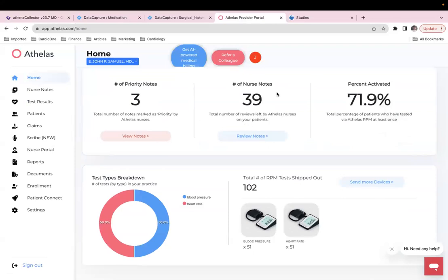But the beauty of this is none of our staff, the providers or the practice staff, need to come here to do anything. I'm just pulling this up to show the complete outsourced services and what they use. We do have visibility, but there is no need for us to come and do anything here because of the integration that we have with the RPM application.